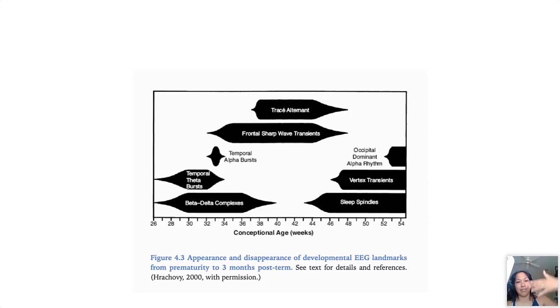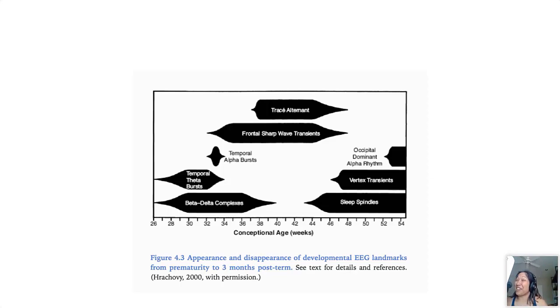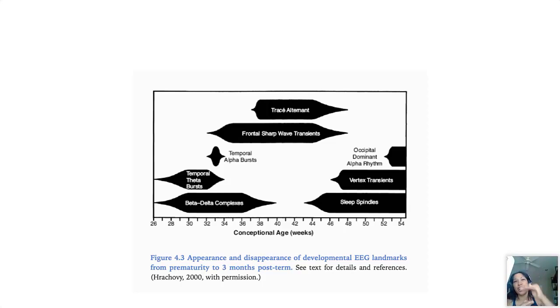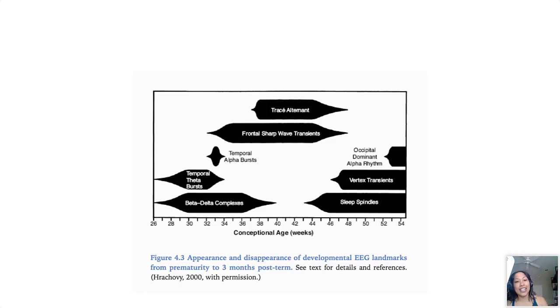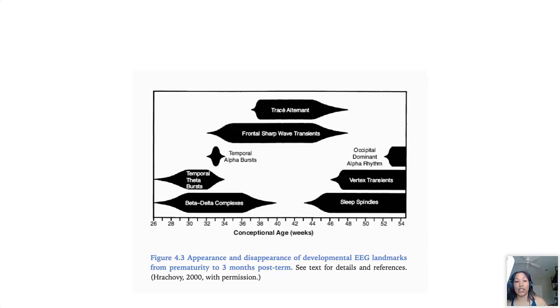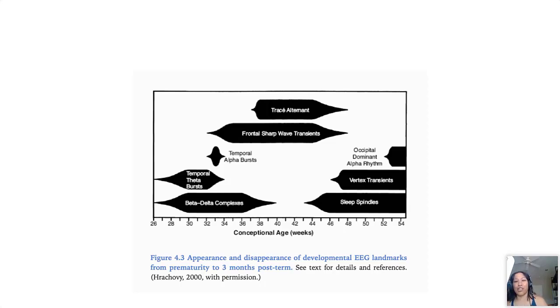Tracé alternant—that's another one of these neonatal EEG French terms—that refers to kind of that a mild degree of discontinuity during sleep when the amplitudes are higher and then come a little lower and go up higher and a little lower, alternating between those two, and that's why it's alternant. And that's, you can actually see all the way up until about six to eight weeks of being alive and not in gestation. Meanwhile the things that you expect to see in adults like sleep spindles and vertex waves and a PDR, those come a little later.